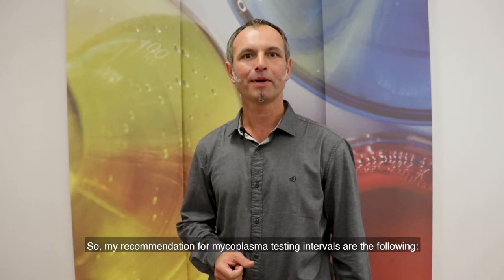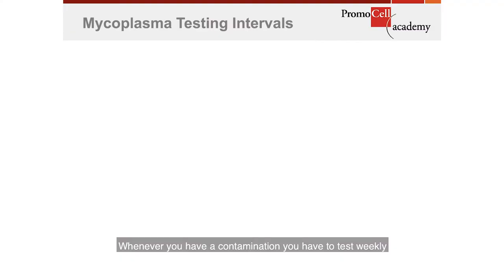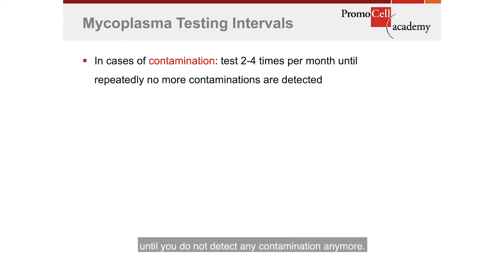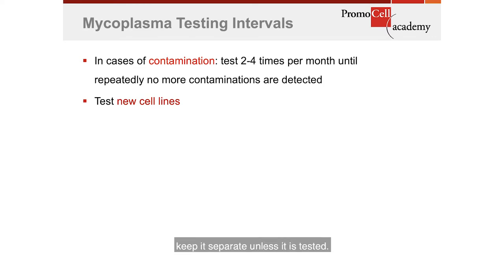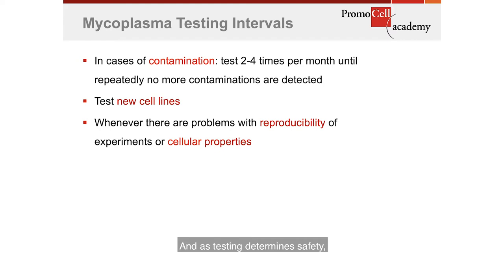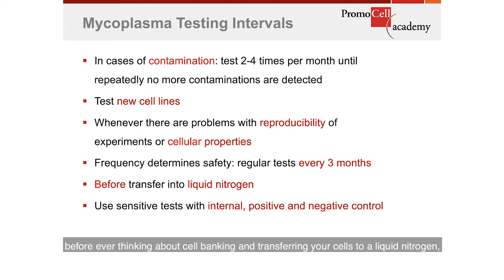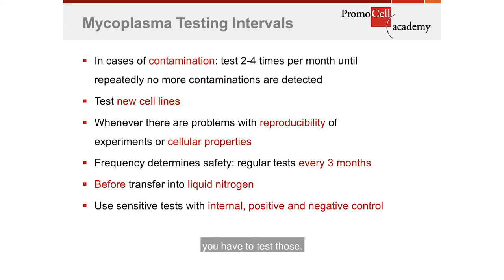My recommendations for mycoplasma testing intervals are the following. Whenever you have a contamination, you have to test weekly until you do not detect any contamination anymore. If you ever have a new cell line arriving at your lab, keep it separate unless it is tested. Whenever you have problems with reproducibility of results or with cellular morphology, think about testing. And as testing determines safety, a three-month interval for routine testing is recommended. Last but not least, before ever thinking about cell banking and transferring your cells to liquid nitrogen, you have to test those.